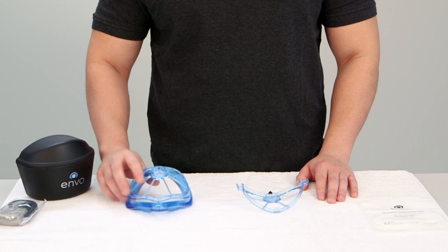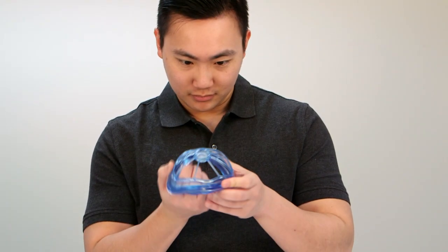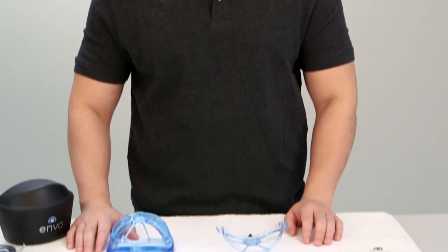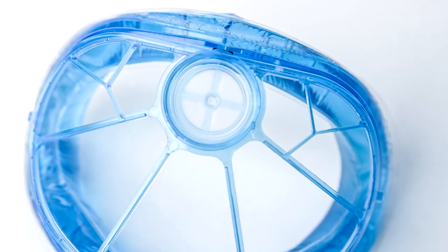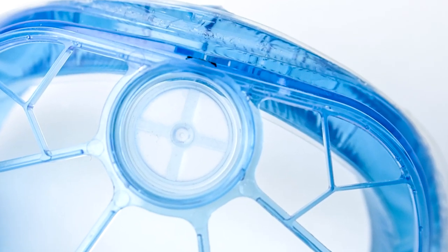Examine the one-way valve and verify it is lying flat inside the mask body. If it is not lying flat, please adjust before putting the filter cover on the mask body. Remember to inspect the one-way valve after cleaning the mask or any other form of handling the mask.